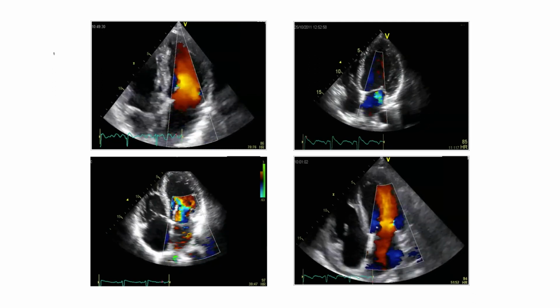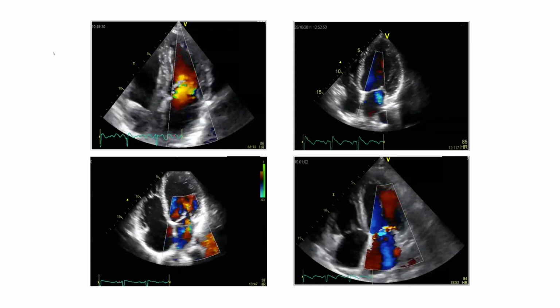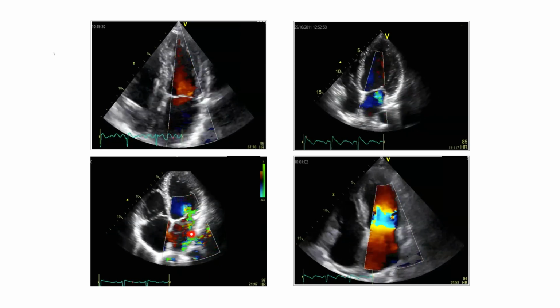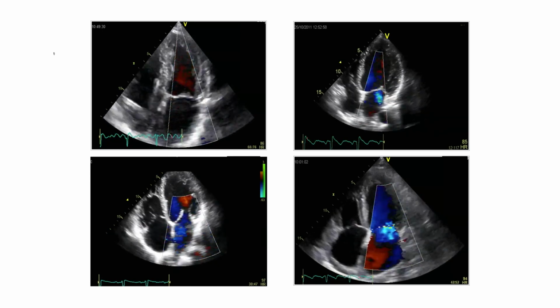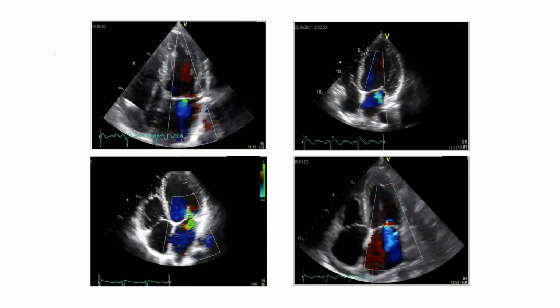This is the second example. The third example. This is a nice jet, I would say. And here is the fourth example. And here is the answer.